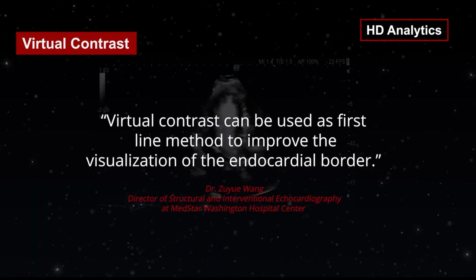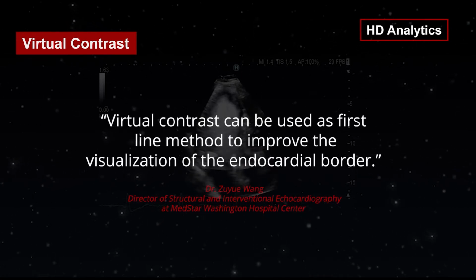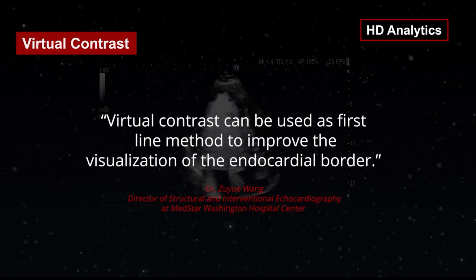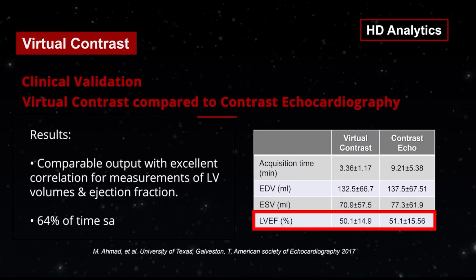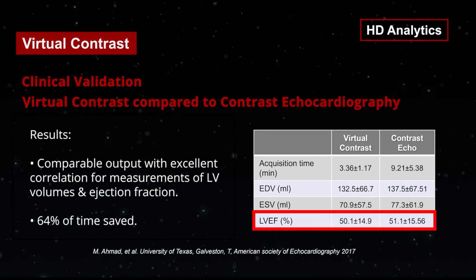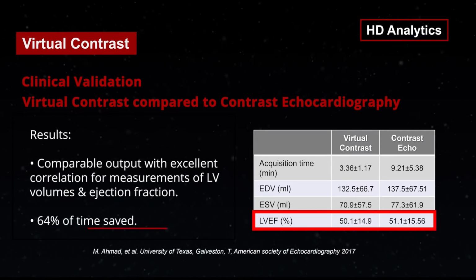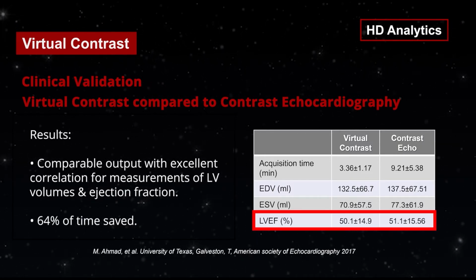With drastic improvement of the visualization of endocardial border, virtual contrast can be the first-line method in the assessment of left ventricular function. Virtual contrast has been proven to provide comparable results in LVEF analysis and has significantly shortened the examination time, in comparison to LV opacification.